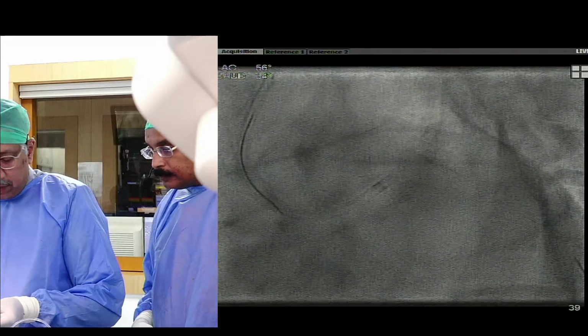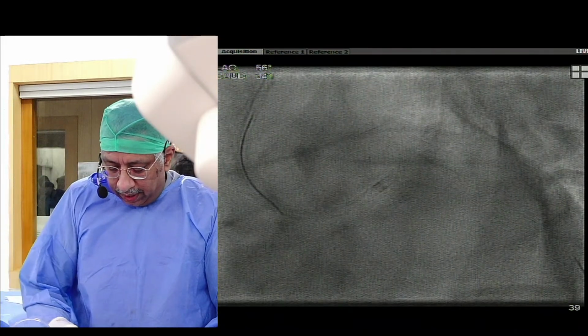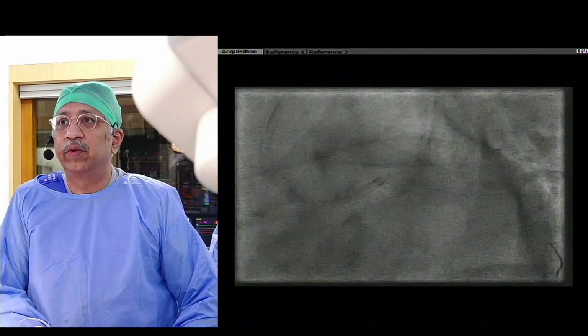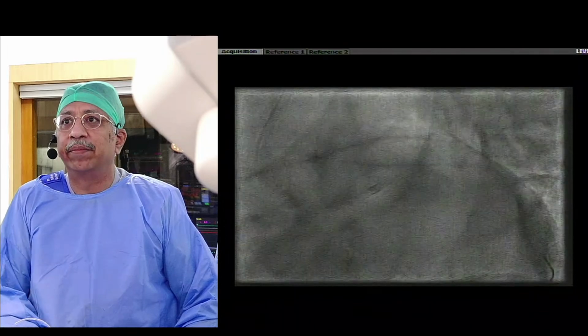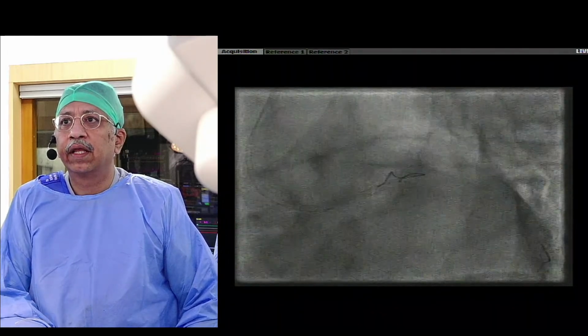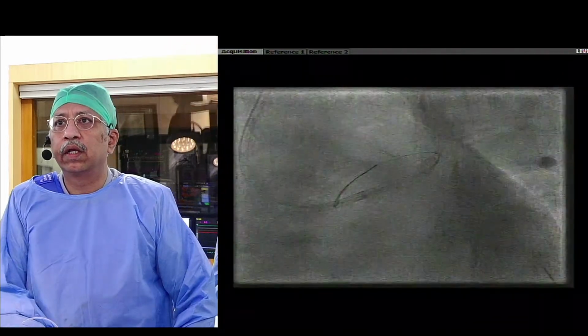In the ER showing anterior wall motion abnormality. Right now, after this we'll just do an OCT run. In case we can show them the OCT run if they are permitting us. That's what the angiogram shows, a clear cut lesion in the LAD, full of thrombus, and just a single vessel lesion.